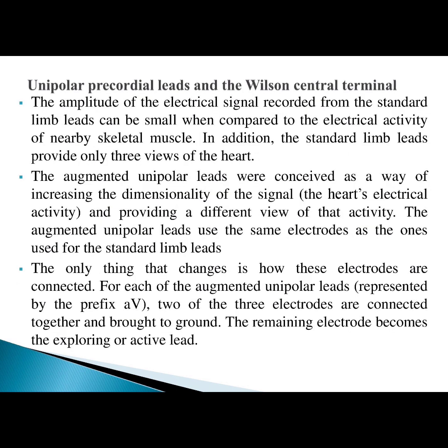Unipolar precordial leads and Wilson central terminal. The amplitude of the electrical signal recorded from the standard limb leads can be small when compared to the electrical activity of the nearby skeletal muscle. In addition, the standard limb leads provide only 3 views of the heart. The augmented unipolar leads were conceived as a way of increasing the amplitude of the signal and providing a different view of the heart activity.